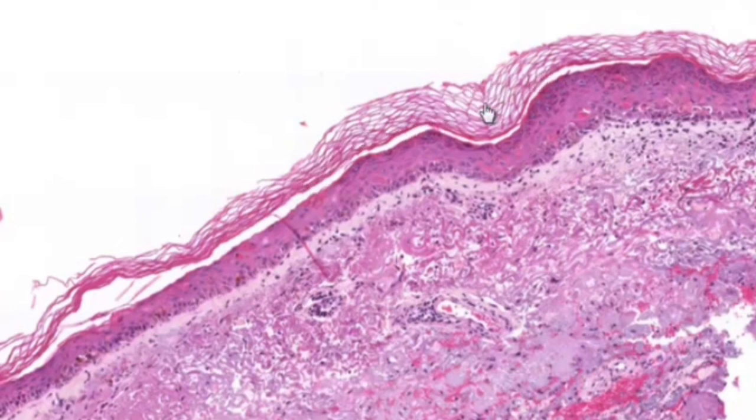Now, if someone were to biopsy a lesion that were several days old, it would not be uncommon to find some parakeratosis present, but typically one would find more hyperkeratosis and parakeratosis in graft versus host disease than one would typically see in Erythema multiforme. Both diseases can be characterized by dyskeratotic keratinocytes, although the presence of these apoptotic or dyskeratotic cells in both the upper and lower epidermis tends to be more characteristic of Erythema multiforme.